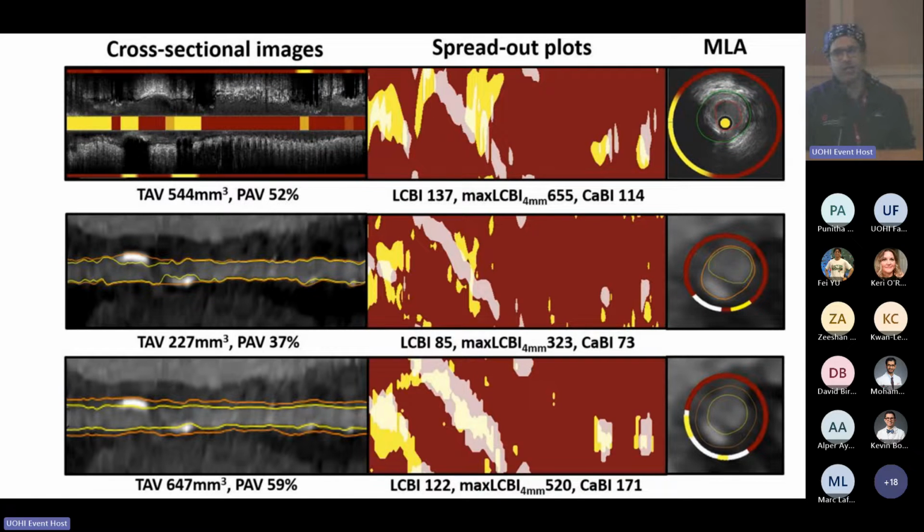I'm going to take them in reverse order, if that's okay, Dr. Shamoon. I actually think the only way to interpret images like this for CT and ultimately intravascular imaging will be via AI, because I just think human beings, even core labs, are not very good at looking at these images. I had to delete some slides this morning because I thought it would go too long. But one of the slides I had was a core lab analysis that looked at effectively the top 5 core labs in the world for intravascular imaging, and their kappa for picking up vulnerable plaque was 0.22.